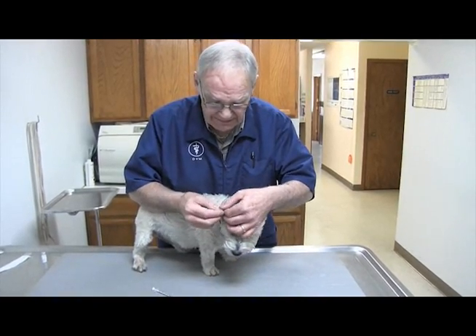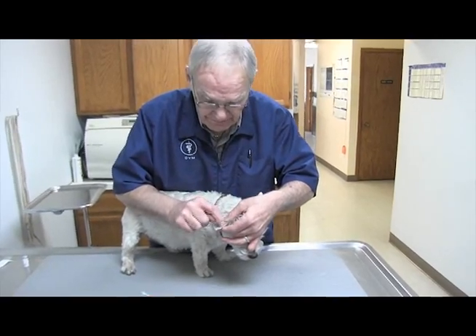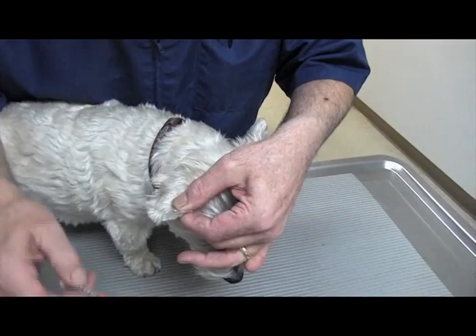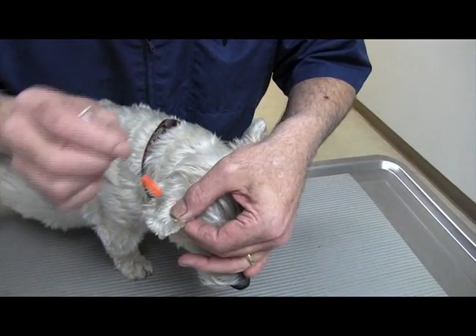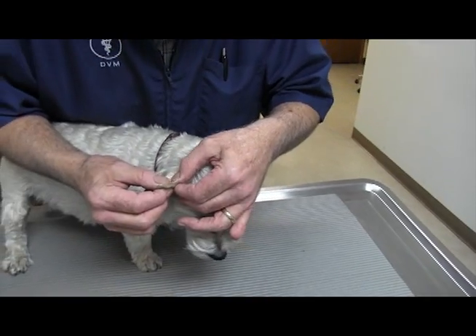Others will clip the hair on the ear, and in the margin of the ear right here is a small blood vessel. You can take a needle and poke that, and get just a tiny drop of blood — that's all you need.